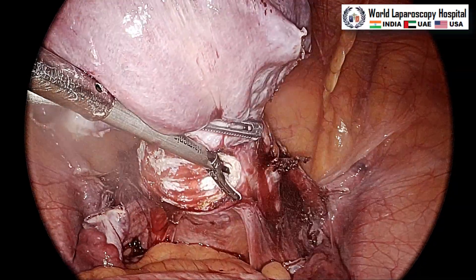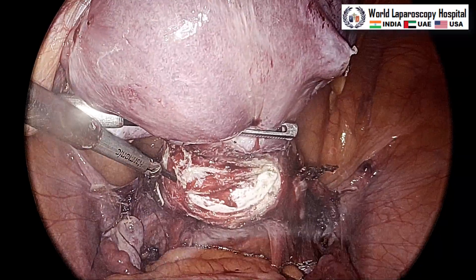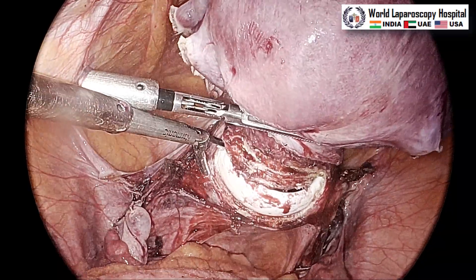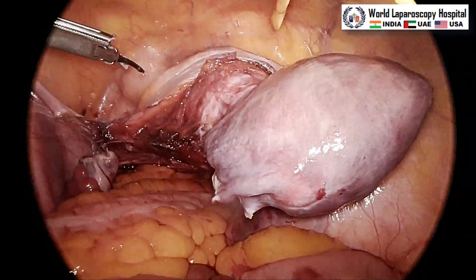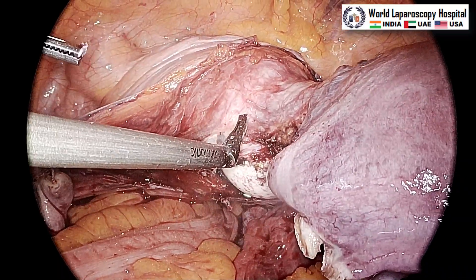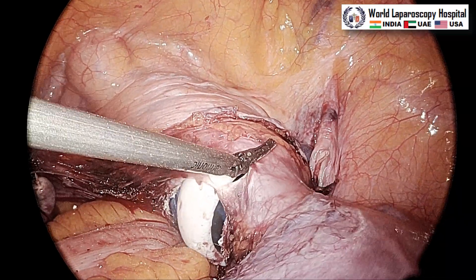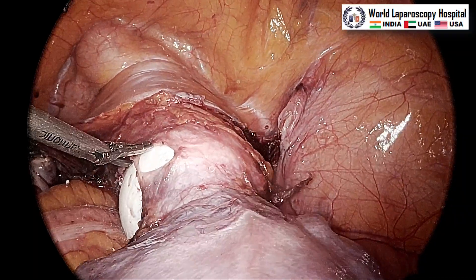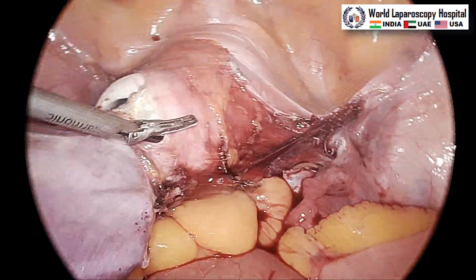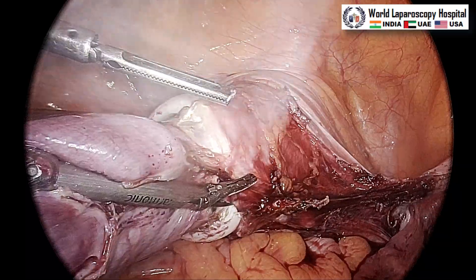The colpotomizer is now visible and the posterior colpotomy is done. The assistant will keep encircling and moving the uterus in coordination with the vibrating jaw of the harmonic. At that time, you should not bring the Teflon jaw near the vibrating jaw, otherwise it will cut and destroy the harmonic. Now it is cutting the anterior leaf of the colpotomy — this is the anterior vagina. The colpotomizer should be cranially pushed by the assistant and with the tip of the open jaw, harmonic colpotomy is easily completed on both sides.